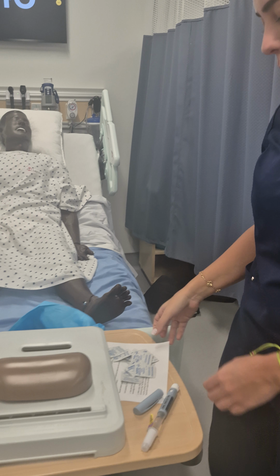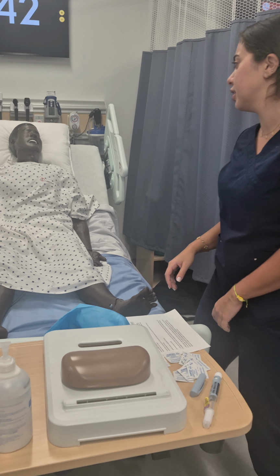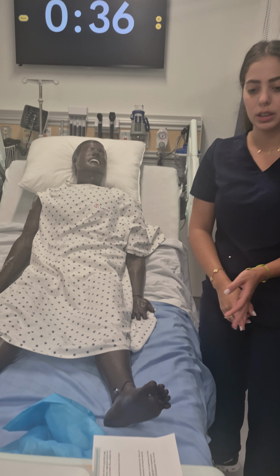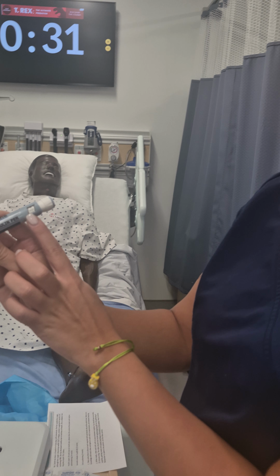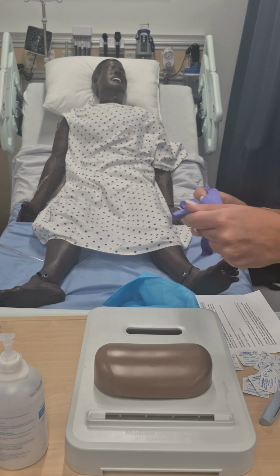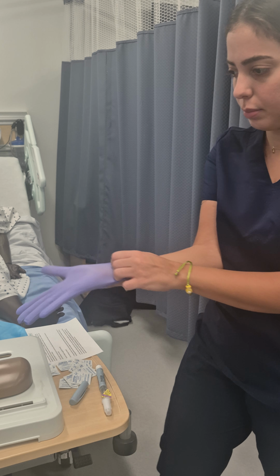Okay, and now I'm going to be administering Mr. Smith's scheduled insulin 3 times a day. So Mr. Smith, I'm just going to be checking your first name, last name, and date of birth. I'm going to be checking it's the right dose, right time, right route. So I'm going to be injecting 10 units of insulin. I'm going to be starting with hand hygiene and putting on my gloves. And this is going to be inserted into the abdomen.